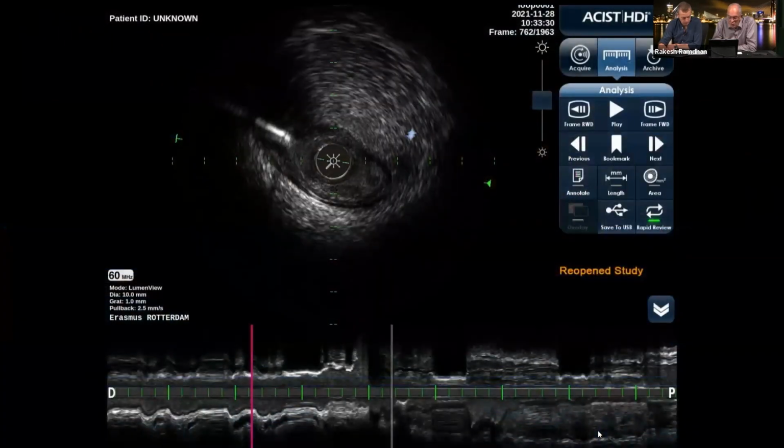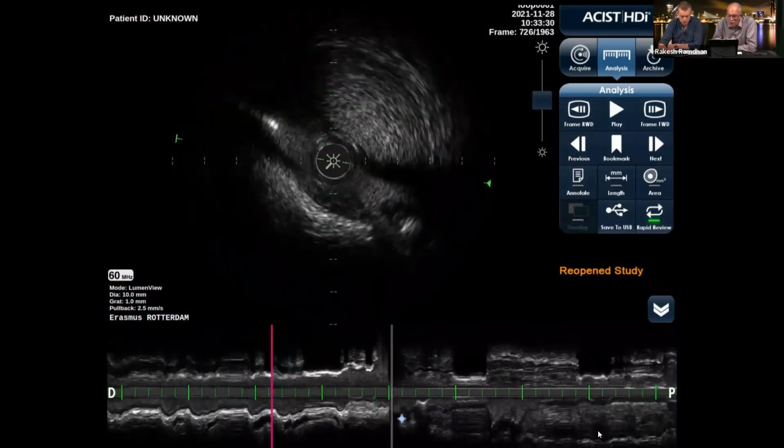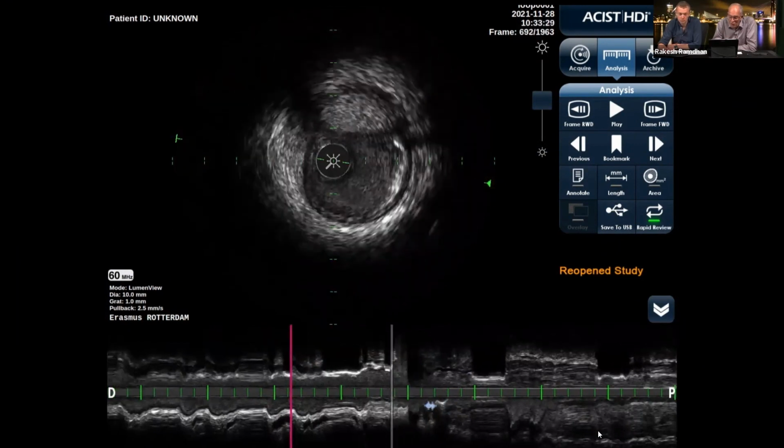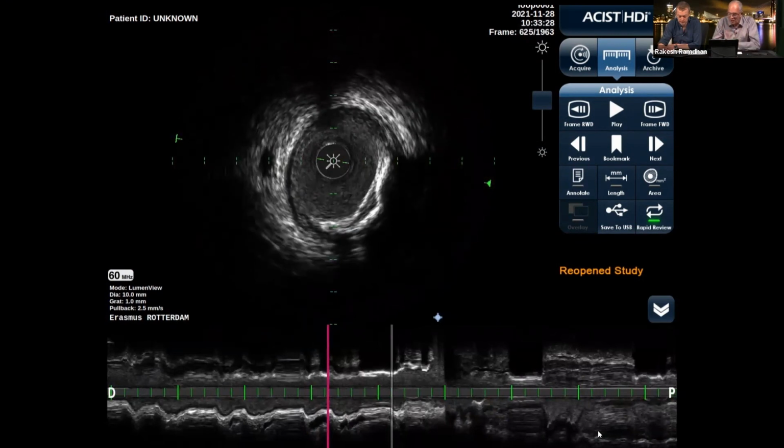I've one additional thing. If this happens to you, if you see this, keep your wits together. Don't make this your vessel size. In this case, you say, well, it looks like a huge vessel, but it's nothing to do with the vessel. It's a blowing up adventitia. If you choose a landing zone, choose this one and forget the size of that, because if you cover the dissection at the end, the size of the adventitia comes back in there.